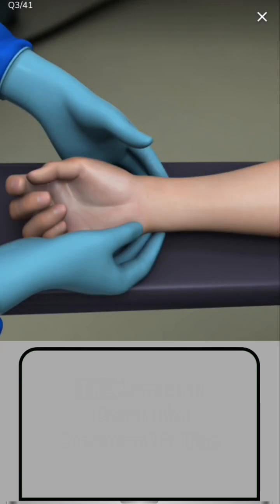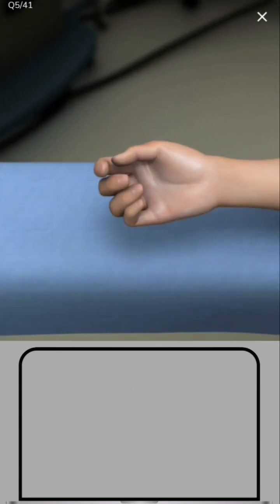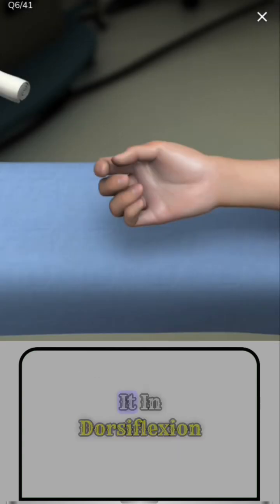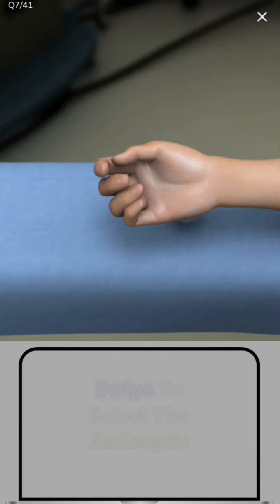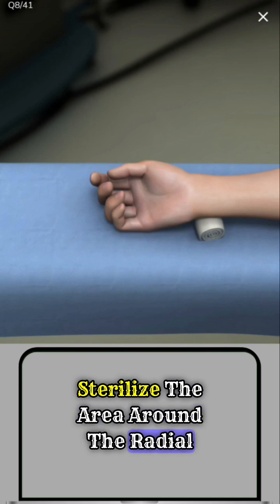Place a towel under the arm and reset the forearm to the anatomical position. Swipe to select the swab roll. Place the roll under the wrist to put it in dorsiflexion. Swipe to select the antiseptic swab. Use the antiseptic swab to sterilize the area around the radial pulse.